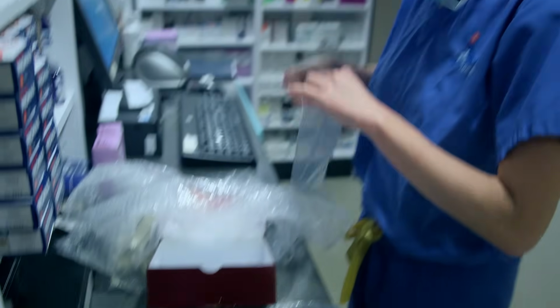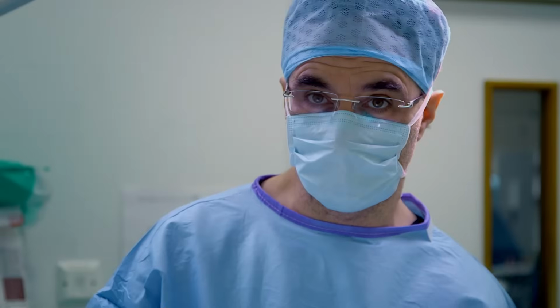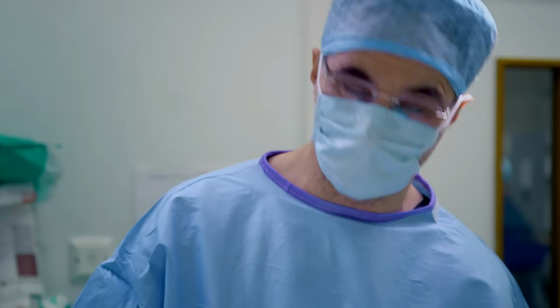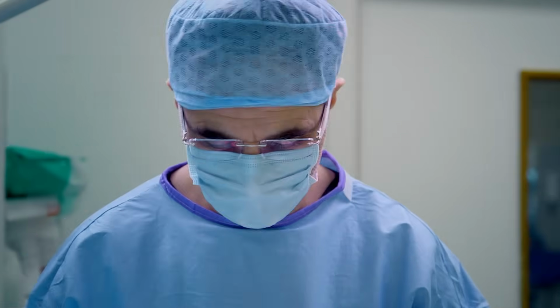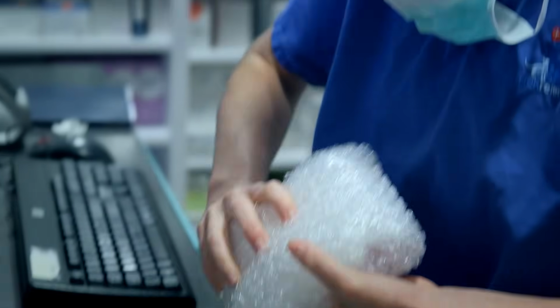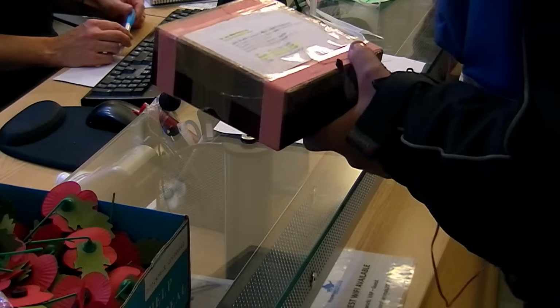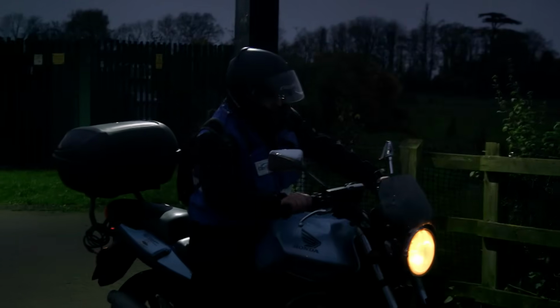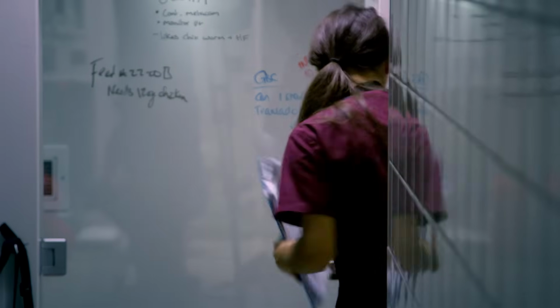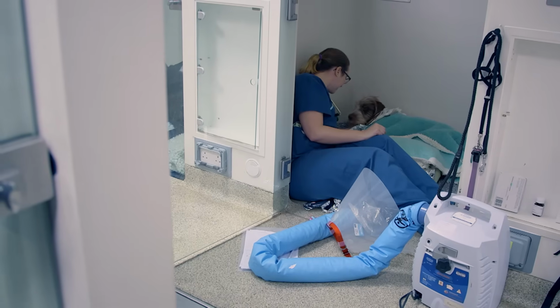What we hope for is that the new synthetic surface seeded with those living cells will grow into a new joint surface. And then Flo will have effectively a normal joint. That's the plan. We're finishing here. The cells are taken to a specialist lab at University College London. Noel hopes he's extracted enough to cultivate millions of new cells to fill the hole in Flo's shoulder.